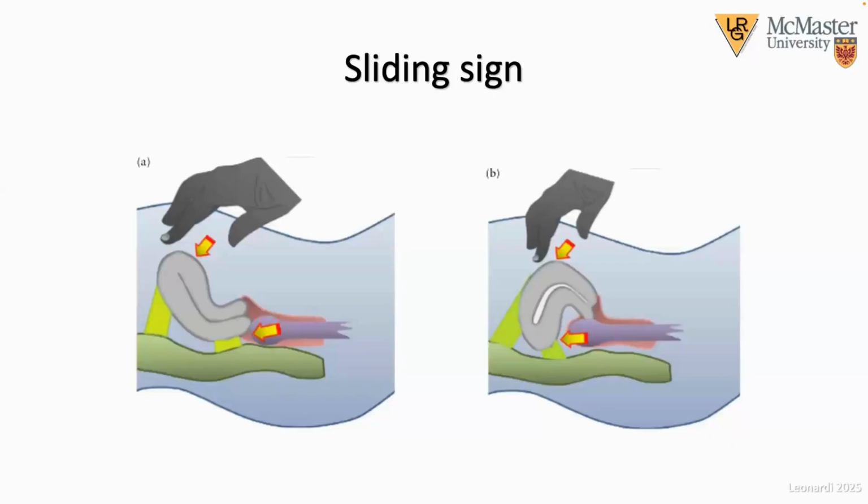And the final portion of this talk before we end is the sliding sign. I think that the sliding sign is the first thing that many centers around the country have considered introducing, and maybe rightfully so, because this has one of the most impactful decision-making experiences for patients and their gynecologists in the clinical setting when surgery is being planned.